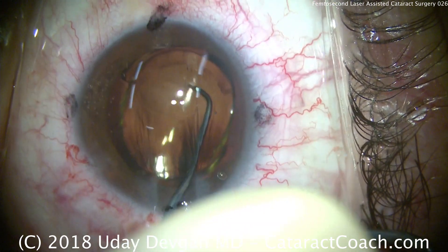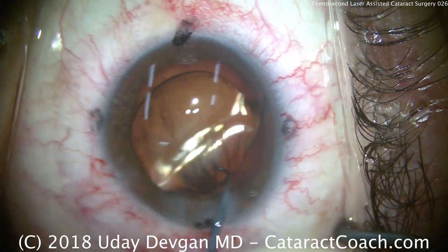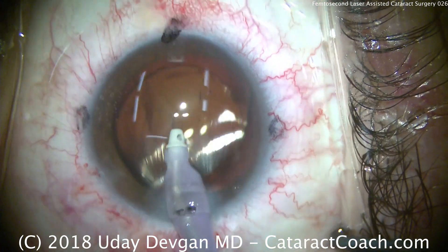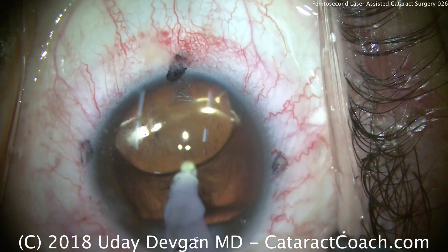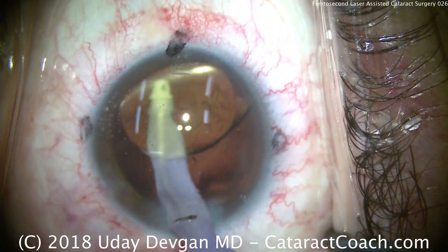The lens is rotated slightly to facilitate going behind it to fully remove the viscoelastic. We lift up on the lens and go behind it to remove that viscoelastic, and once that's completed we'll remove the viscoelastic from the anterior segment as well.